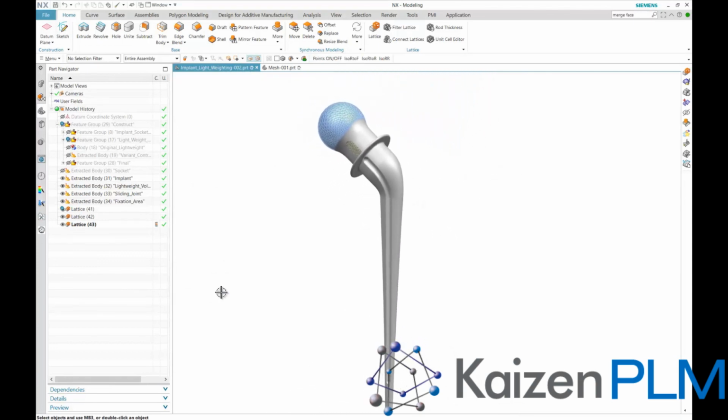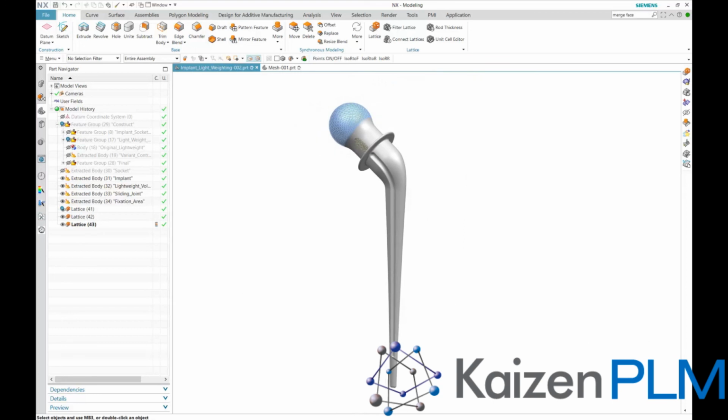This concludes the demonstration on the really great enhancements to Lattice implemented in this release of NX.